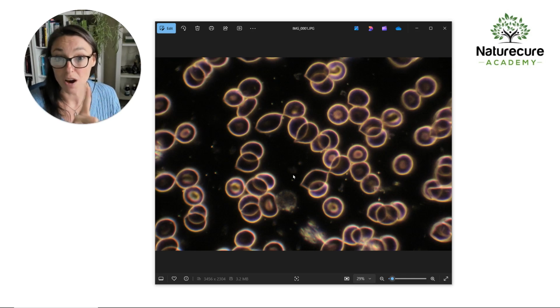Now, we ask people to fast for 5 hours before the blood analysis session. This is so that the body can clear away all those particles. And we have a plasma that is really just showing us other elements that we're looking for when we're doing blood analysis. We want the food out of the picture. But if somebody has fasted for 5 hours, and this person did, and they still have quite a lot of these particles floating around in the plasma, then it tells us something about the integrity of their gut lining. It tells us something about the speed at which their body is digesting.